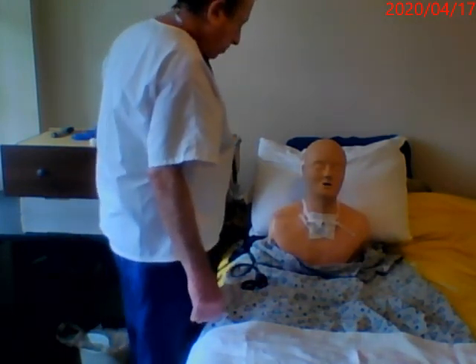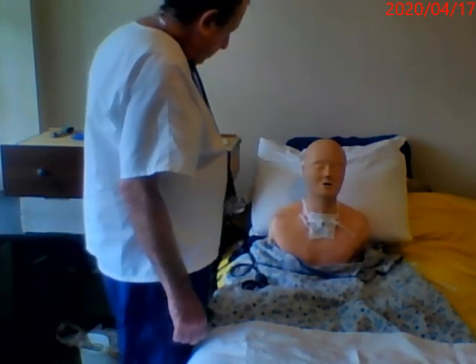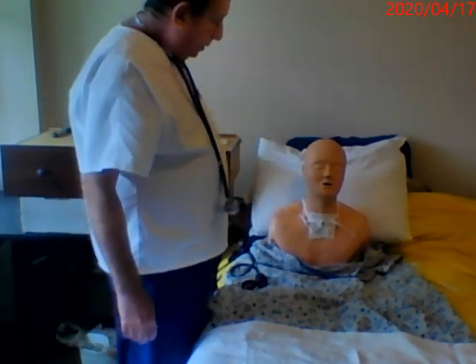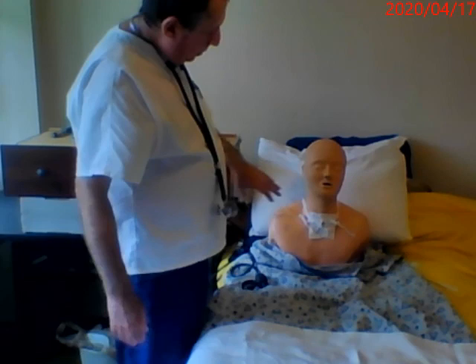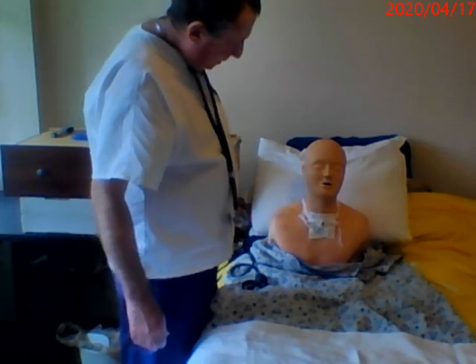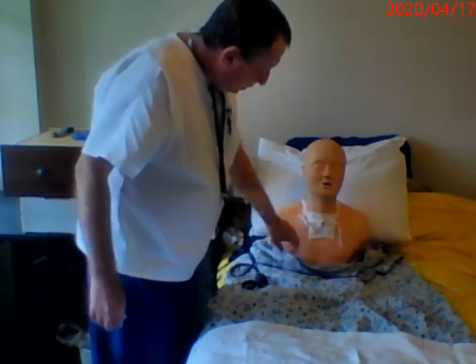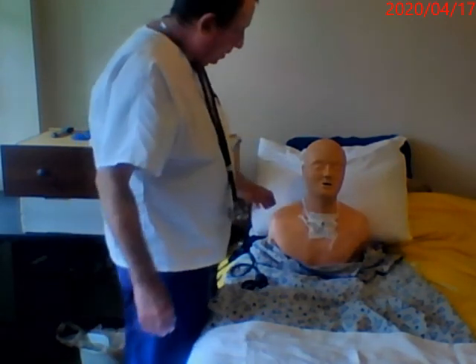Next, I would auscultate the chest, which is the last part of my exam. I'm going to be looking for 3 types of sounds: bronchial, bronchovesicular, and vesicular. Bronchial sounds I'm going to hear up in the neck and at the apices. Bronchovesicular sounds I'm going to hear close to the sternal borders on the anterior side of the chest. And vesicular sounds I'm going to hear on most of the anterior chest and on the back.